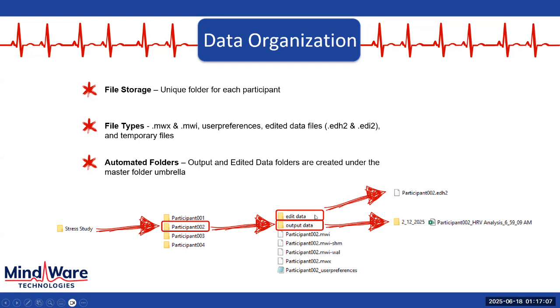Then if we make any edits to the file during our analysis component, an edited data file will also be created. So it is nice that these subfolders are created underneath the participant folder. If you have all of your participants for a study underneath the same folder, that's fine. It just is a little bit easier, when we're doing further analysis, to have these subfolders organized.